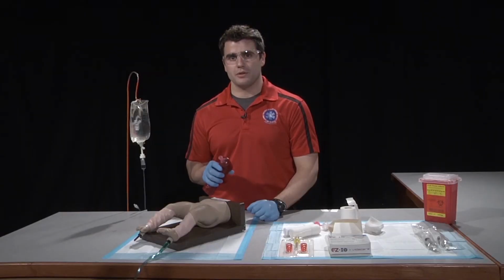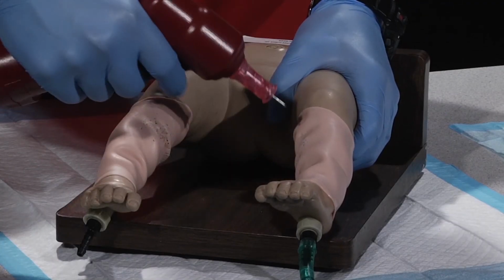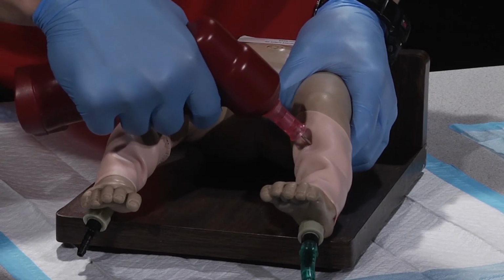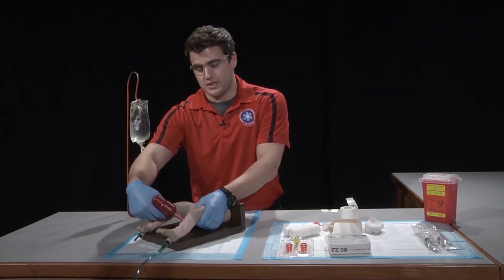After inspecting for burrs, we're going to stabilize the leg, making sure our hand is not underneath or near the puncture site. We're going to advance the needle at a 90-degree angle and make our puncture. Once the needle has entered the intramedullary canal, you will feel a pop and notice less resistance.